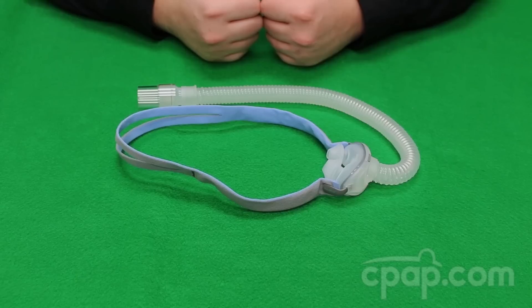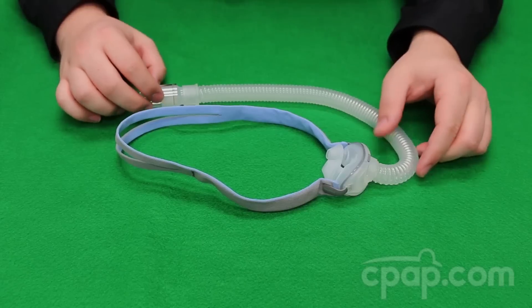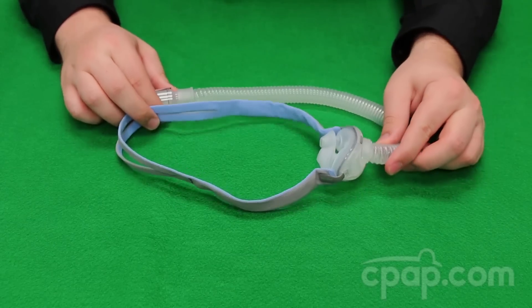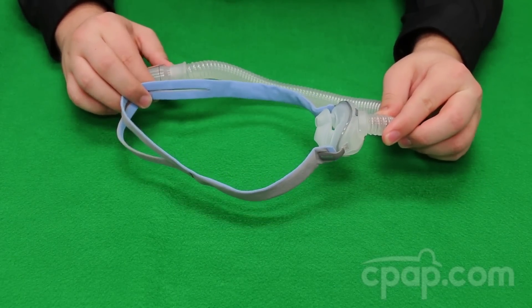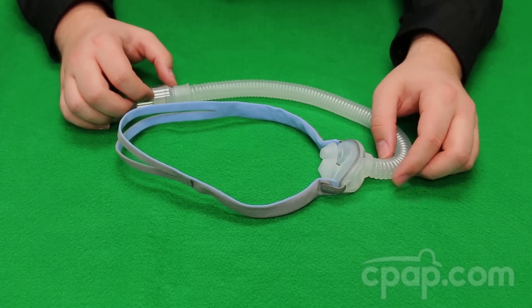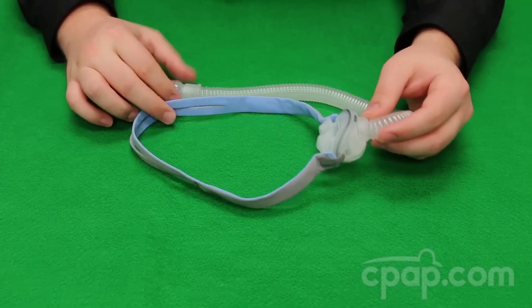Chris here with CPAP.com to introduce the AirFit P10 Nasal Pillow CPAP Mask with Headgear by ResMed. The AirFit P10 is a lightweight, simple-to-use adaptation of other popular ResMed nasal pillow masks. It is approximately 50% lighter and 50% quieter than the Swift FX and has been named ResMed's quietest mask to date. The mask weighs approximately 1.6 ounces when assembled.